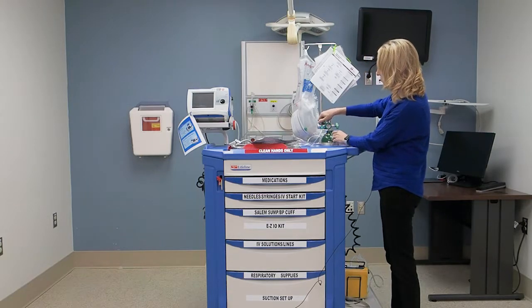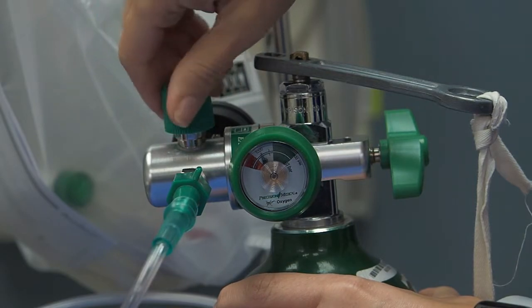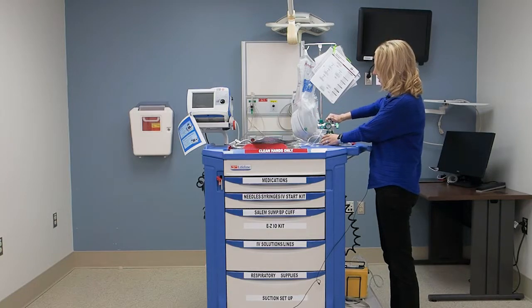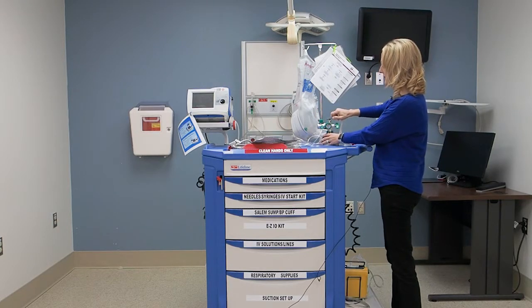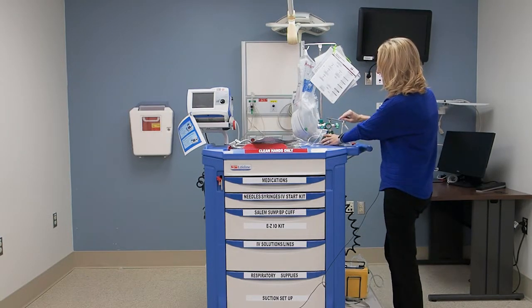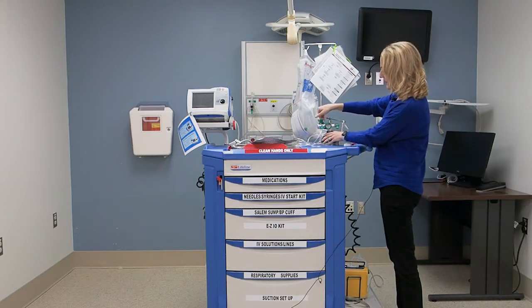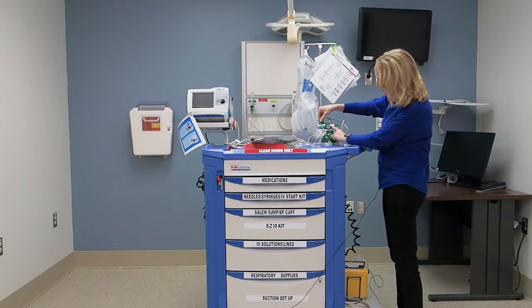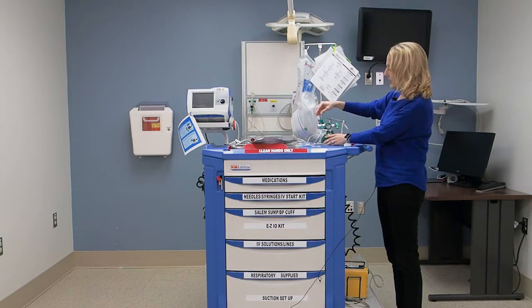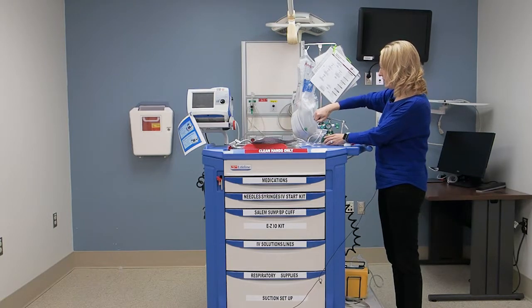The next thing you're going to do, once you open it, is use the flow meter to turn the oxygen on, and then it will be ready for use for the patient. When you're through with it, you would turn the valve back off. Then what we have to do is bleed the extra oxygen out of the tubing, and you do that by turning the flow meter in the on direction, and you will see that the arrow will go back into the red. Once it's in the red, you can turn the flow meter off, and it is labeled on and off.